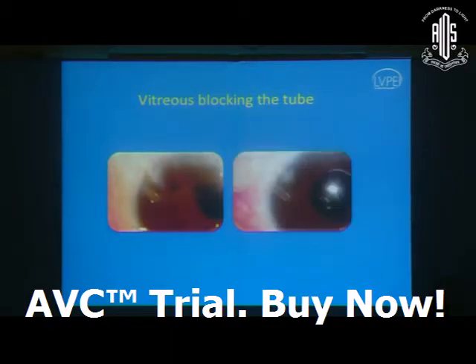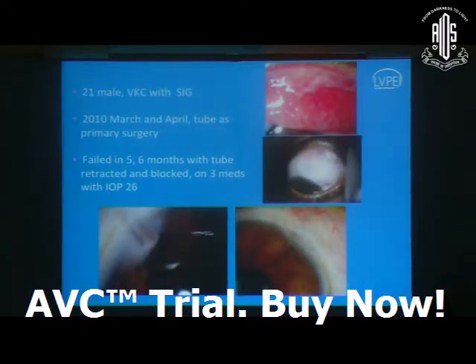So this child required a vitrectomy, and because it was a one-eyed child and had an RD in the other eye, this was kind of a quick thing you had to do because just the vitreous traction itself can lead to posterior segment problems. So if it is a very small tag, you can also do a vitreolysis, not necessarily a vitrectomy all the time.